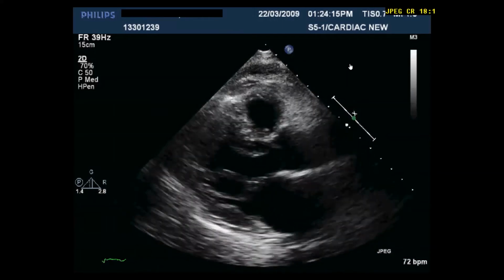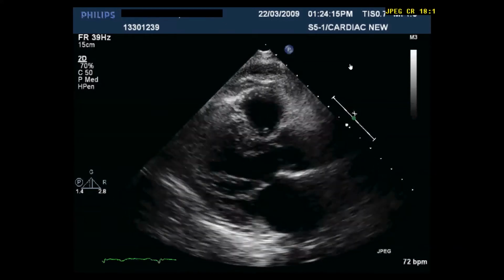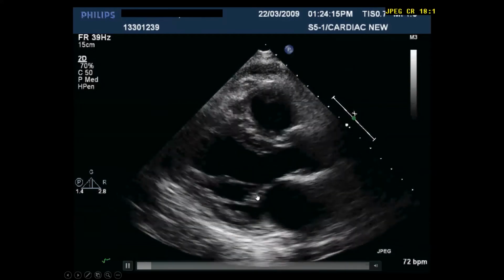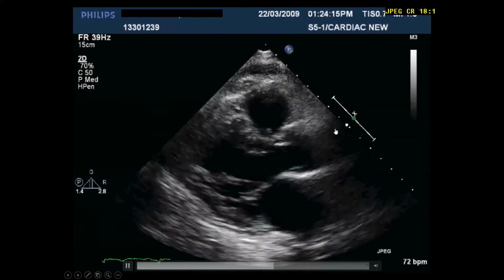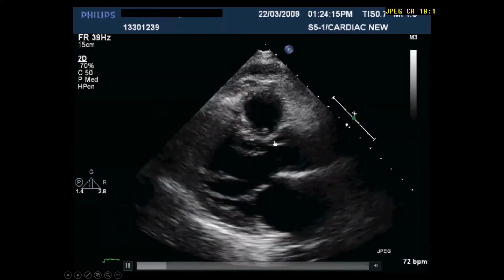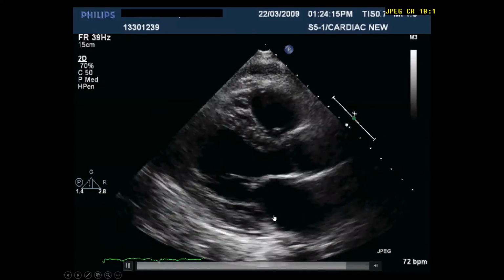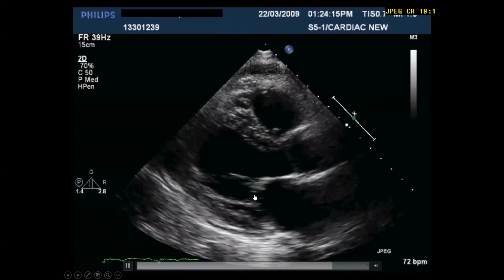There is anterior motion of the anterior mitral leaflet without obstruction. The LVH is quite likely here. And now SAM, not really. Yes, the mitral valve is a bit thickened, but no SAM.